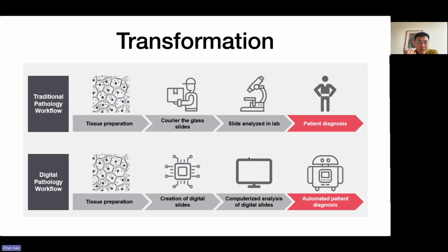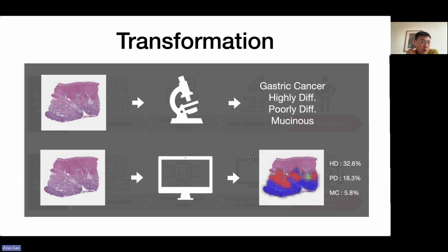If you have digital pathology, you just need to do the scanning and digitalization, and it will be automatically sent to the pathologist or to any other computational aid models to do the analysis, and then checked by the pathologist too. It's much more efficient compared with the traditional workflow.